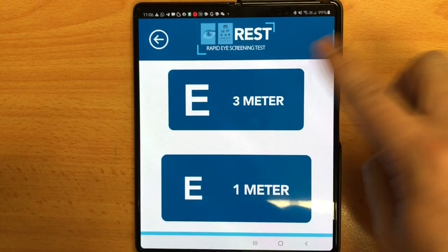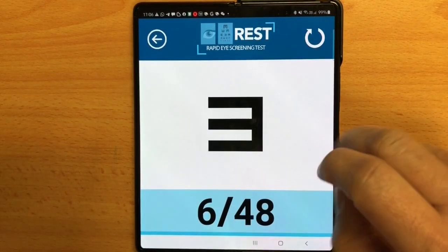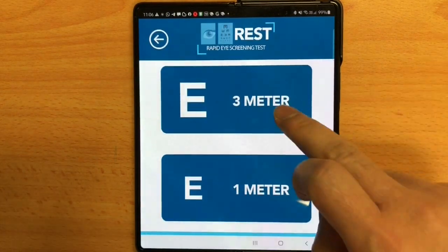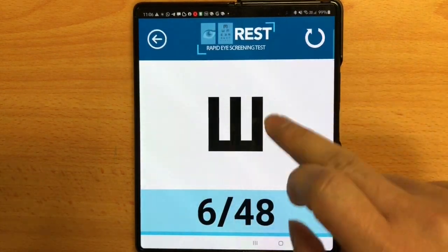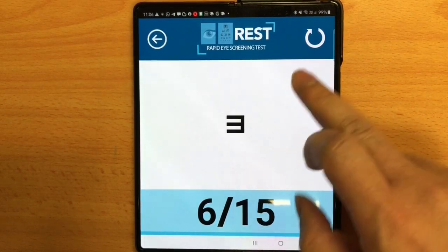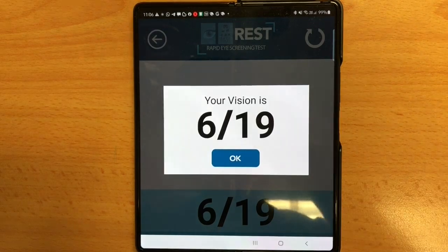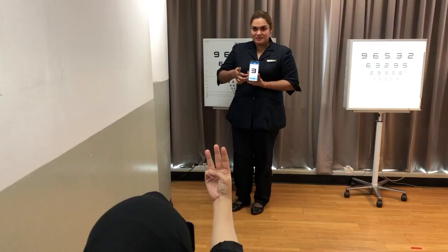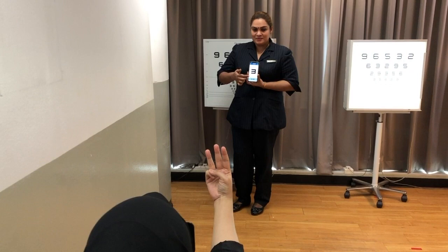If the test subject makes a mistake, the final vision will be displayed on the screen with a negative sound as well. This app has been validated by a study to show that it is comparable to the gold standard EDTRS chart that we use in clinics. This is to show how a test is being done.